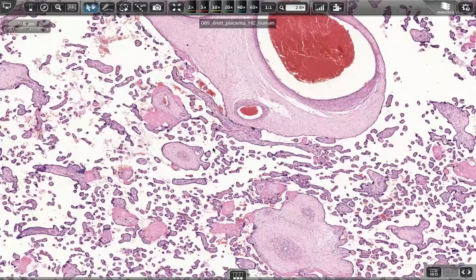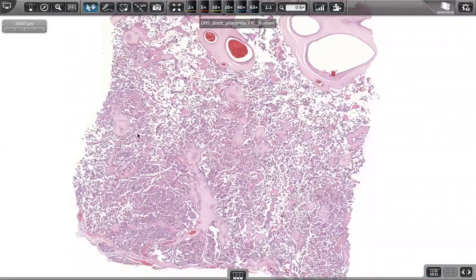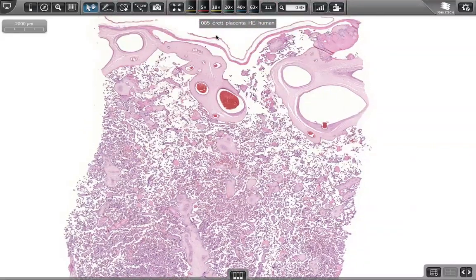So I'll just zoom out. This area represents the cross sections, longitudinal and transverse sections of the chorionic villi. So the mass of the chorionic villi are presented growing from the fetal side. And I'm telling you again, the amniotic layer, amniotic mesoderm, chorionic mesoderm, chorionic plate and villi are all derived from the extra-embryonic mesoderm.